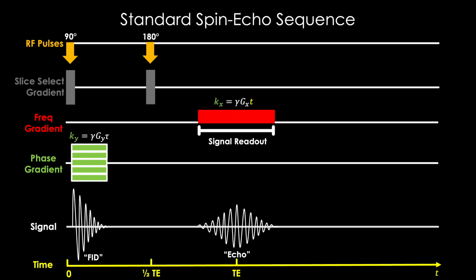Well, remember, we also need to collect frequencies in the y direction. We're trying to generate a two-dimensional picture with information needed in both the x and y dimensions. So we need to do the exact same thing with ky as we did with kx, but we have a problem. For various reasons, we cannot apply these at the same time. We only get one of these freebies.